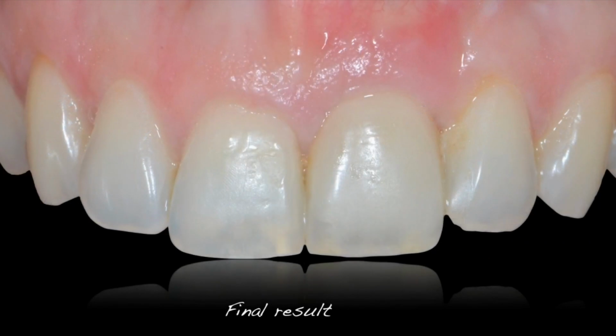of the implant after, of course, a provisional phase in which the tissues were pushed out buccally only by pressure, and to adequately create that contour and preserve what was rebuilt of the bone. And this shows clearly with a great tissue match, a great interdental papilla that is present, and of course a great ceramic work done by the referring doctor.